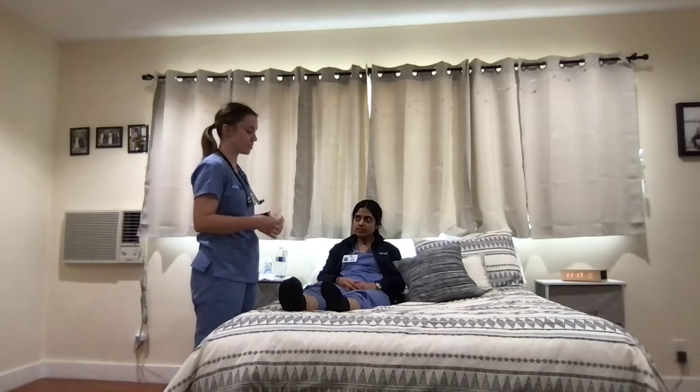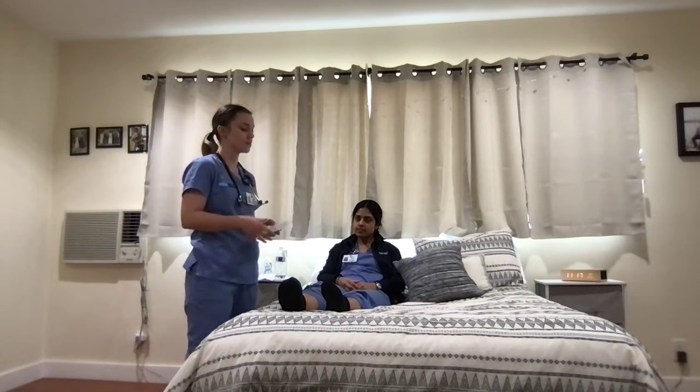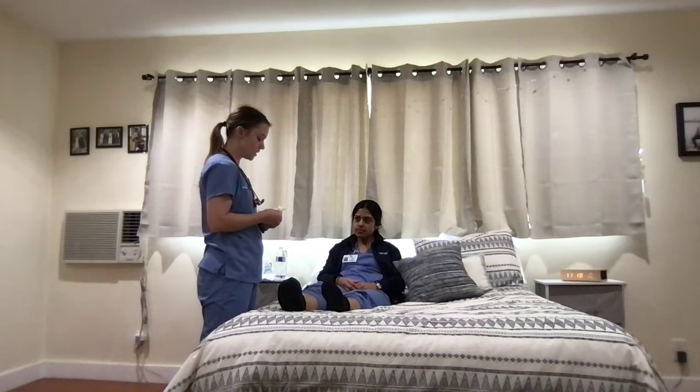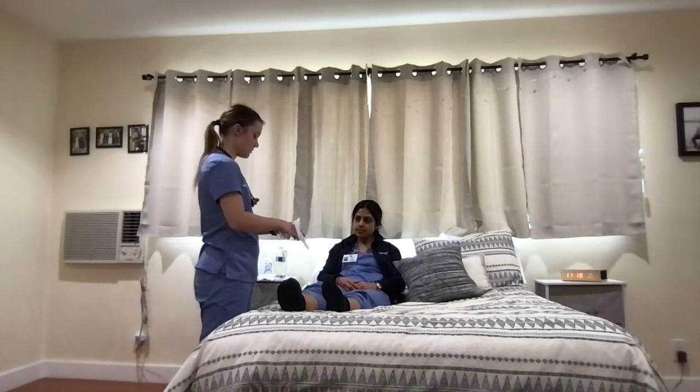So the incentive spirometer is used to kind of wake up the lungs a little bit more after surgery. The lungs go to sleep as the body goes to sleep when we perform surgery, so the incentive spirometer is used to help get the lungs to their normal respiratory rate. So I'm going to show you how to use this, and then I'll have you show me.